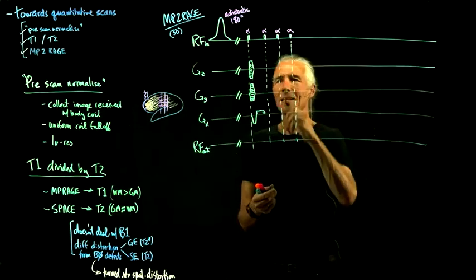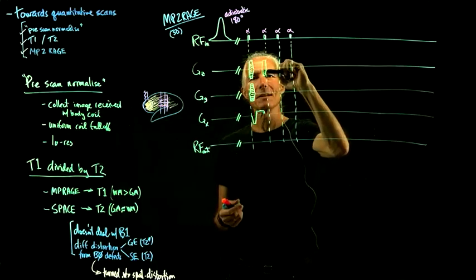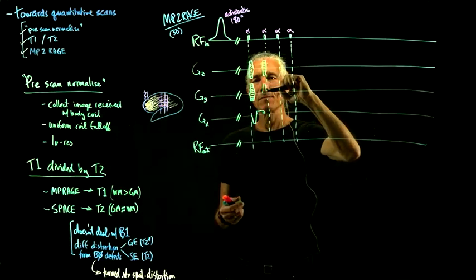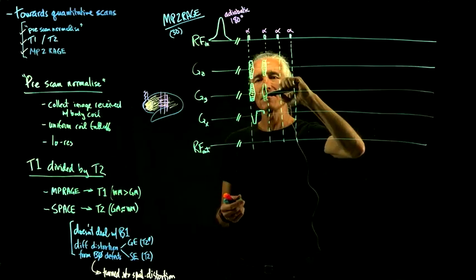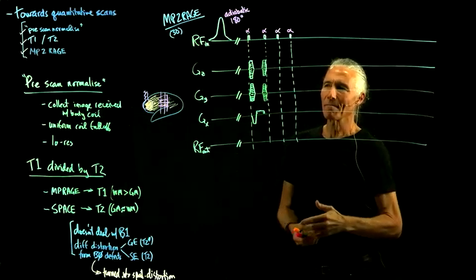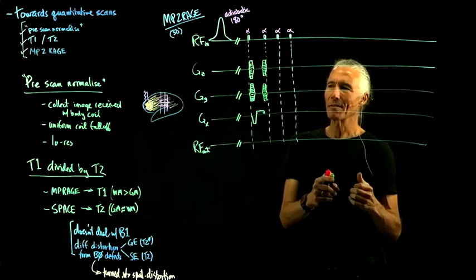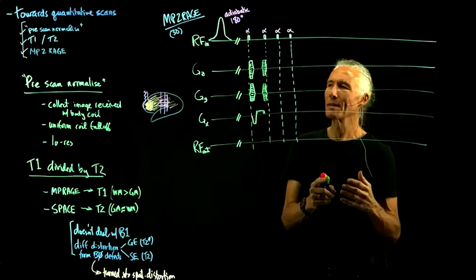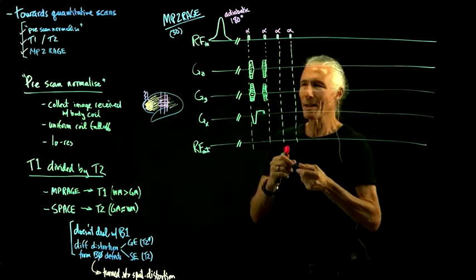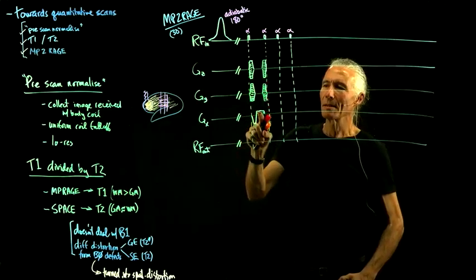But then in addition, you rewind, you kind of fix all the two phase encode direction magnetizations, as if you were doing something more like a GRASS type scan, where you're saving the magnetization. So remember, there were two types of fast gradient echo. You could have coherent or incoherent. So this is more like the coherent one, where instead of trying to squash all the transverse magnetization that you've got at this point.